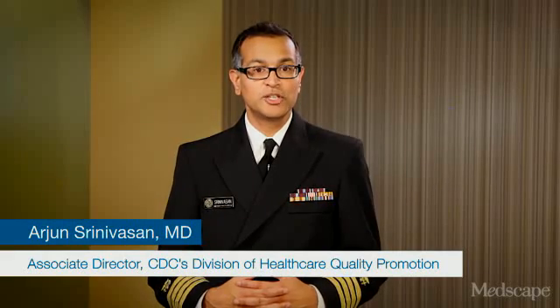Hi, I'm Dr. Arjun Srinivasan, the Associate Director for Healthcare Associated Infection Prevention Programs at the Centers for Disease Control and Prevention. I'm pleased to bring you today this video, produced in collaboration with CDC and Medscape, where Dr. Brian Christensen and infection preventionist Barbara Smith will walk you through the sequence for putting on and taking off personal protective equipment recommended in the new CDC guidance for providing care of patients hospitalized with Ebola virus disease.